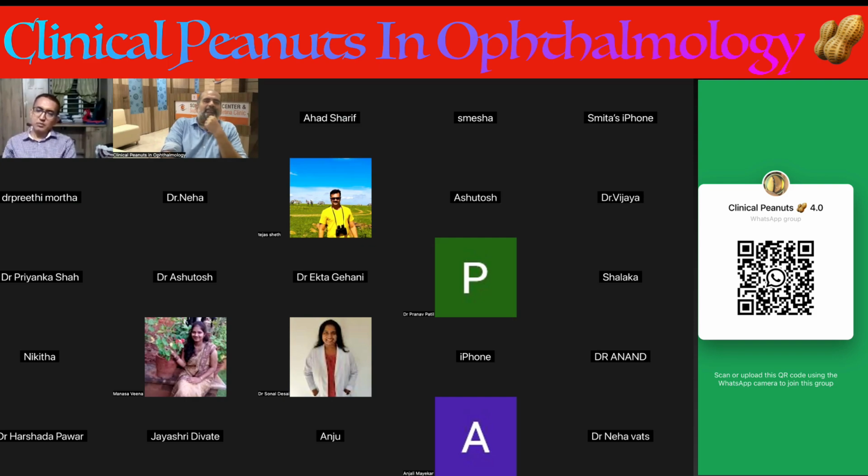So again, a very practical question: a young ophthalmologist who has just started doesn't have all the equipment. He's doing his biometry with the immersion A-scan and K reading from an ARK machine because he doesn't have an optical biometer and he doesn't have a Pentacam or a topography. So yes or no, should he go for a toric? Yes, perfectly he can go for it.